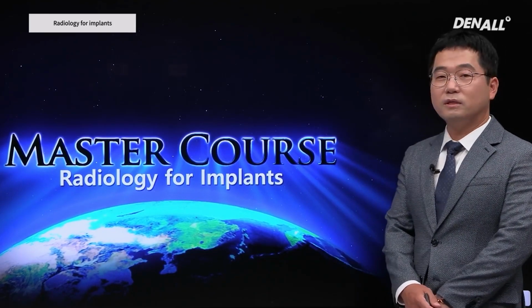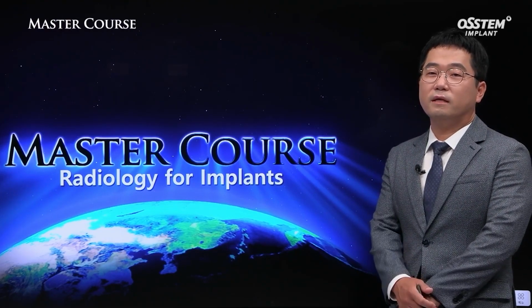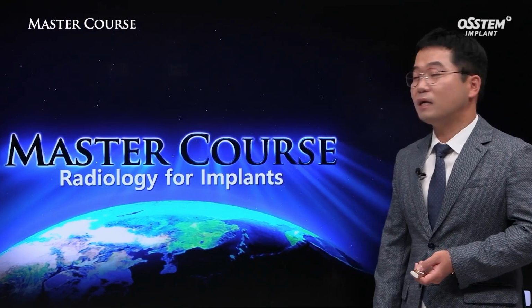Therefore, I would like to briefly address it. In the offline course, we do tracing hands-on practice, but in the online course, I'm going to introduce the anatomical structures that you need to bear in mind.